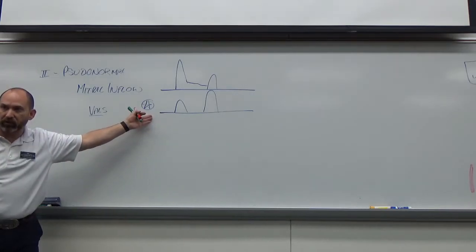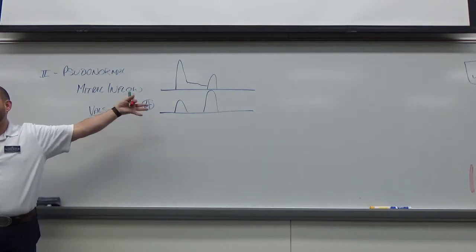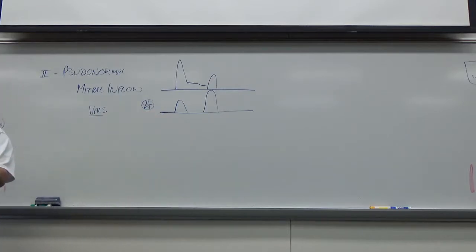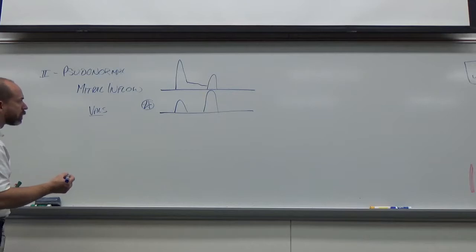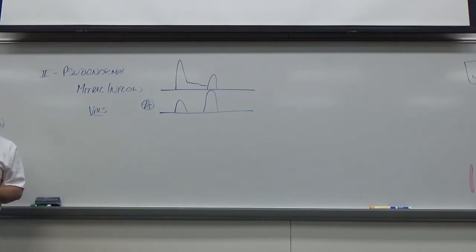Worst comes to worst, this doesn't show me what I think I'm supposed to see, and my tissue Doppler does. I can just exclude this piece of information. But if I see that it does reverse, that just helps prove the case. Does that make sense? Good. So that's what Valsalva does. It may show normal, it may reverse. It depends on how well the patient does it. But I still personally think it's a good piece of information.